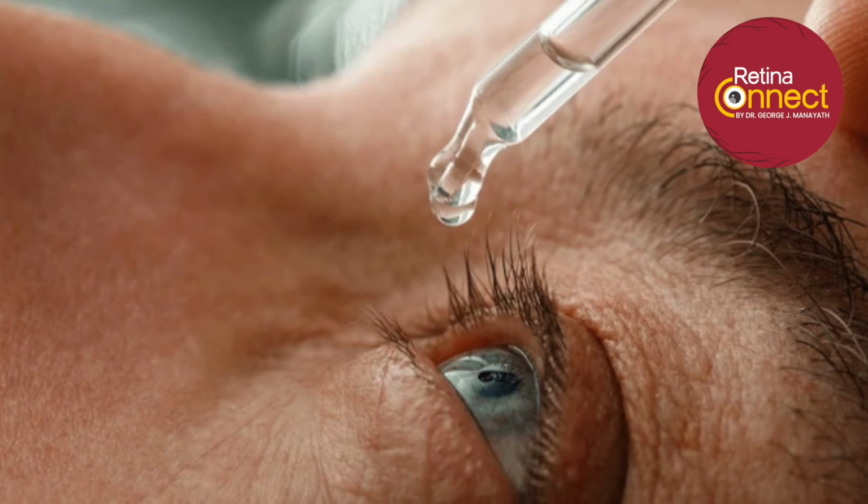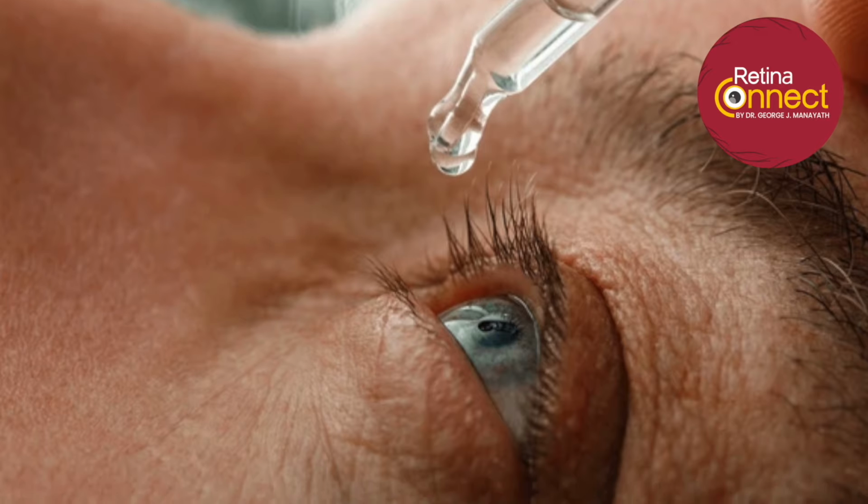pupil-dilated retinal examination, which the ophthalmologist or retina specialist will be able to do. You need to instill the eye drops, dilate the pupil over 20 minutes and have a retinal examination. So that is the basic test to be done.